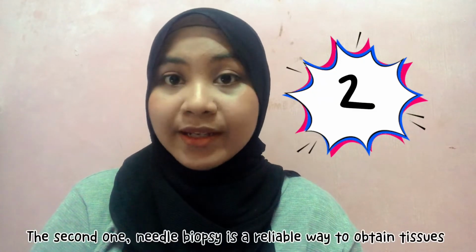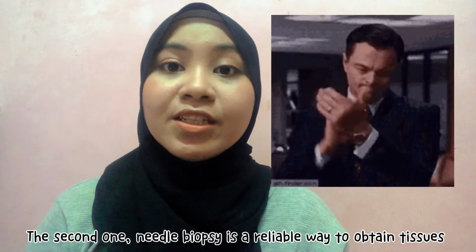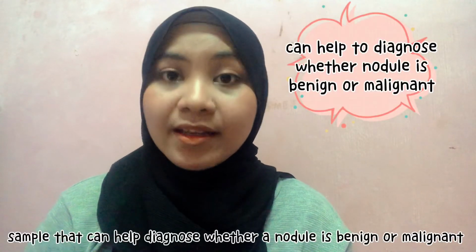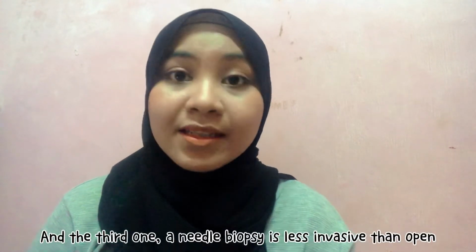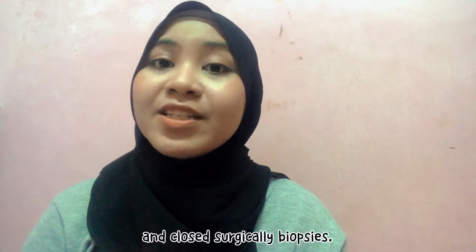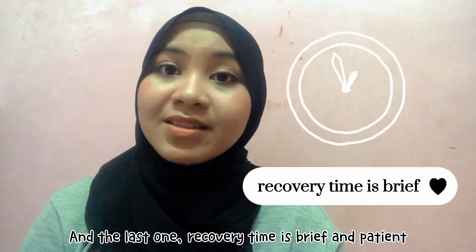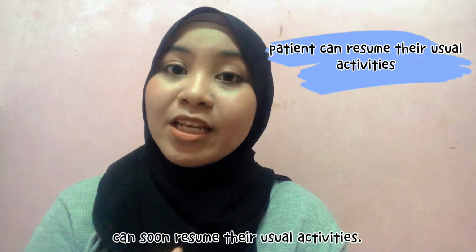A second one, a needle biopsy is a reliable way to obtain tissue samples that can help diagnose whether a nodule is benign or malignant. And the third one, a needle biopsy is less invasive than open and closed surgical biopsy. And the last one, recovery time is also brief and patients can soon resume their usual activity.